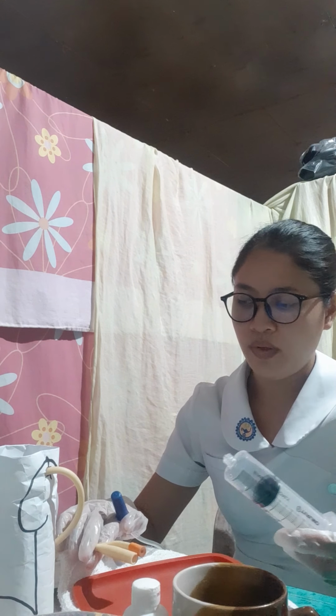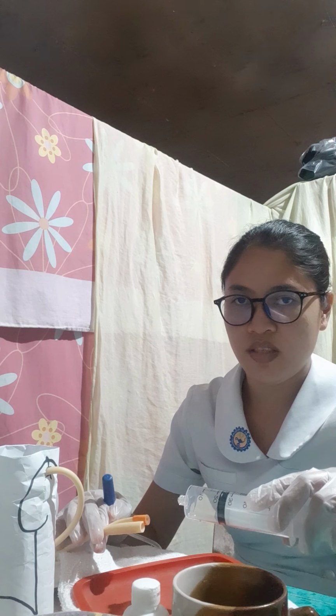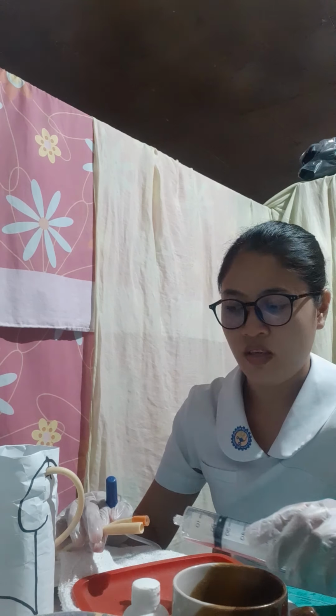So we're going to insert the tip of the syringe into the catheter opening.